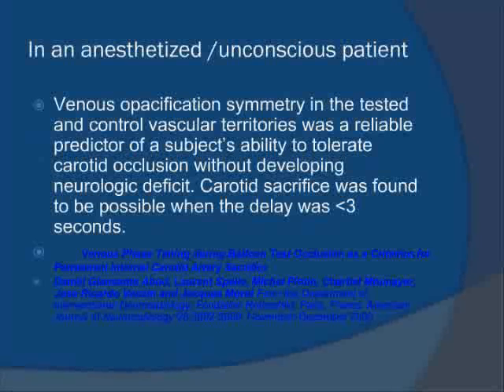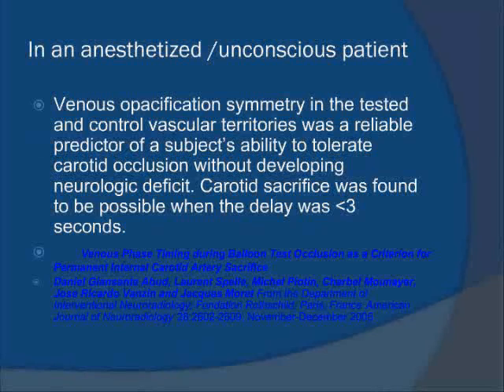Sometimes we may have a patient who is under GA and then we decide to test occlude. So how do you assess? Here the important thing is to inflate the balloon, inject through the opposite carotid and look for the venous drainage on the culprit side or the ipsilateral side. So if the venous drainage on the occluded side is not delayed by more than 3 seconds, or rather it should be less than 3 seconds, then you can be reasonably sure the patient won't have a neurological deficit.